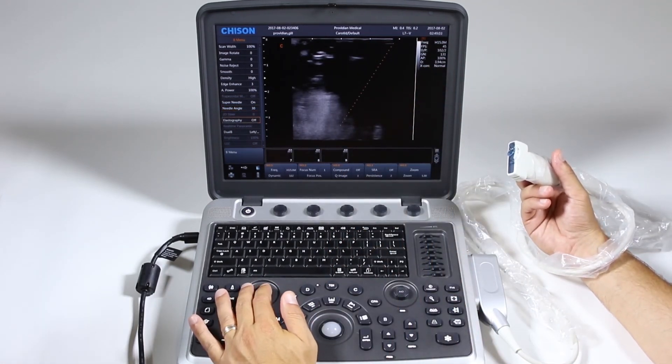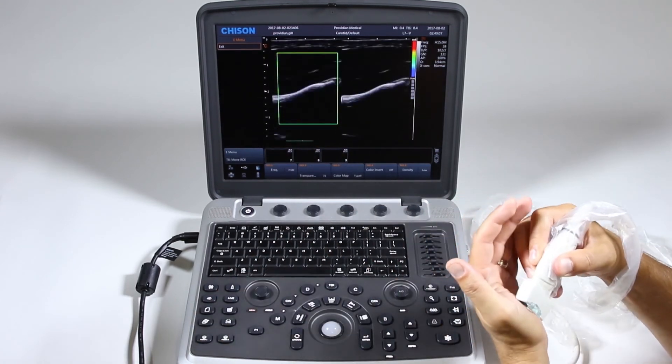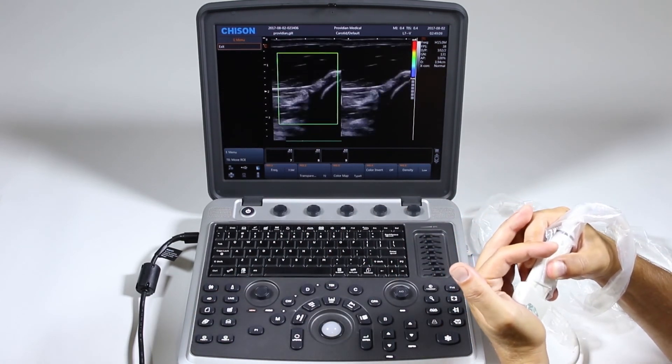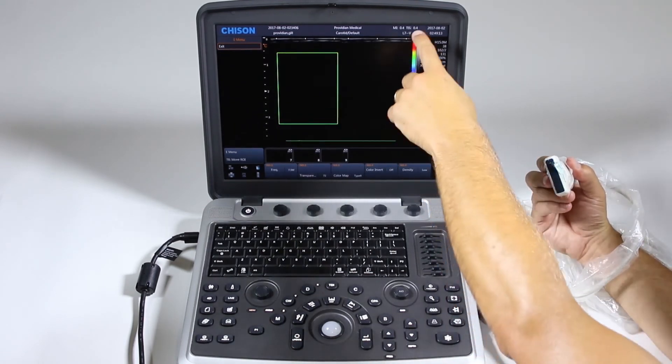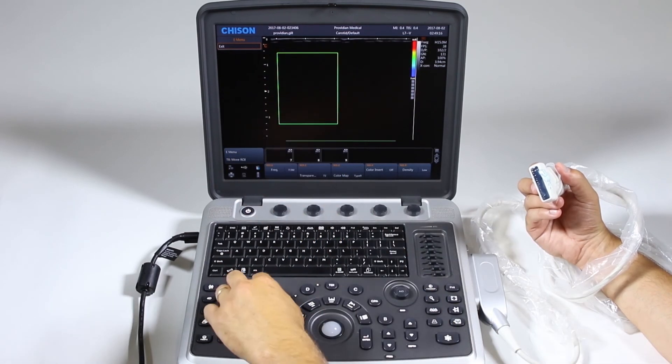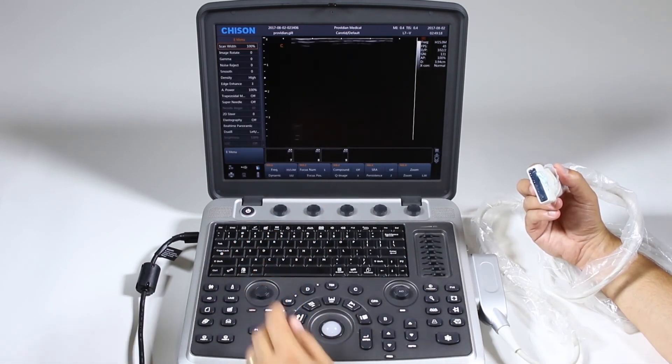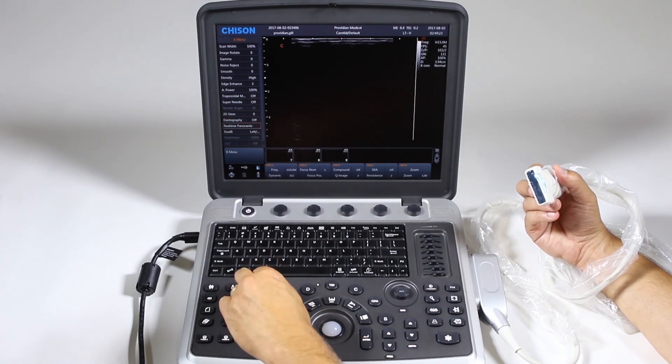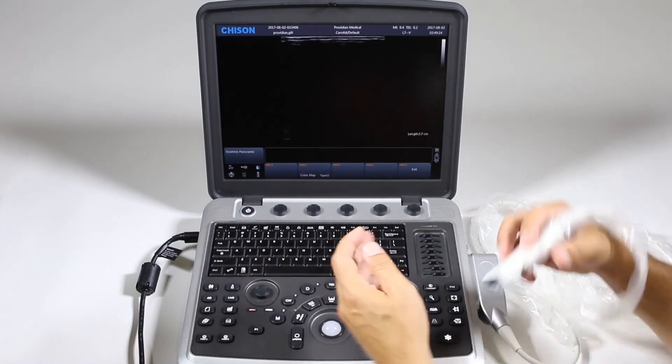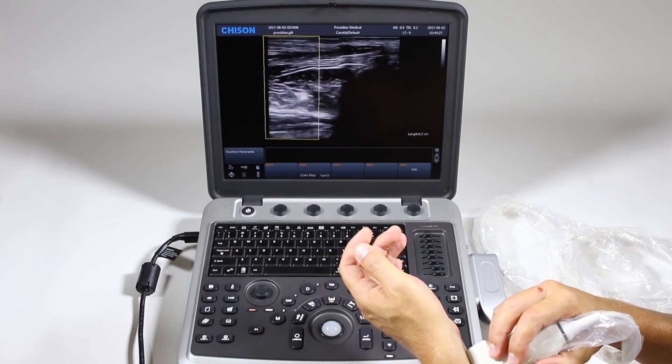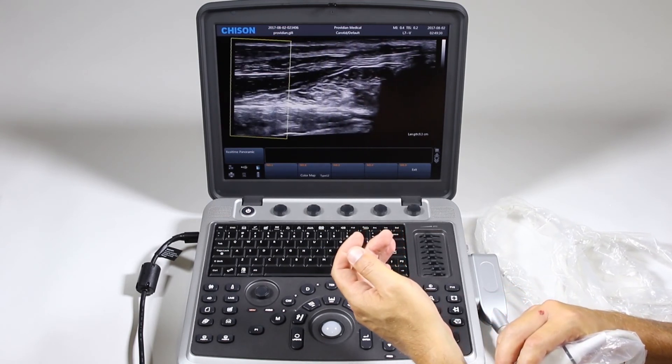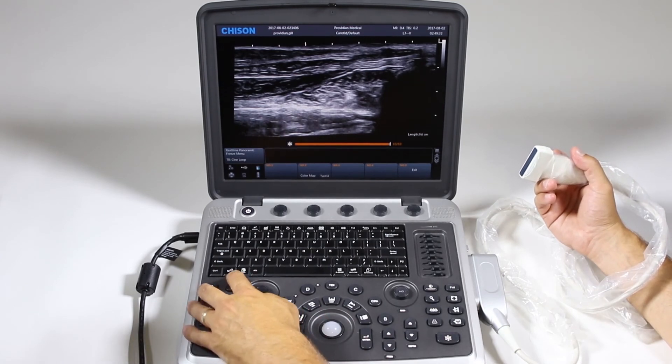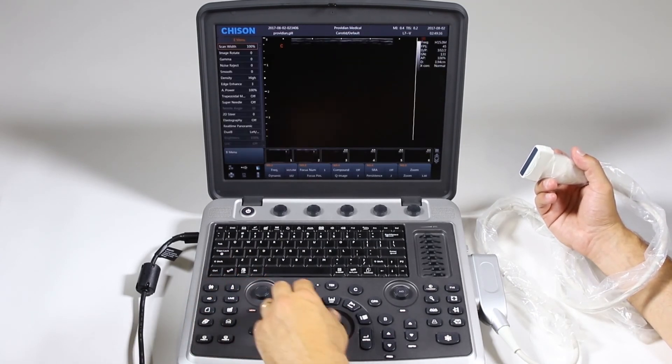Click down again. Elastography is going to show you the elasticity in the tissue there. And you have your scale here. It says exit. So, I'm going to go ahead and exit. Real-time panoramic. You're going to select that. And you can just go right across and scan, and it will put it back together for you. Freeze. Exit. I'm going to go back to menu here.